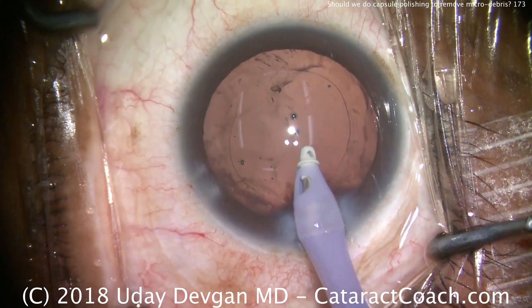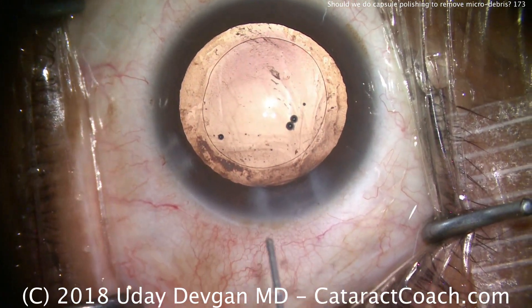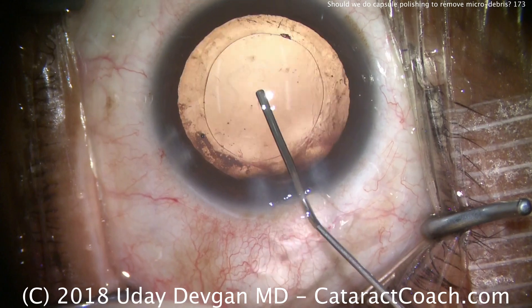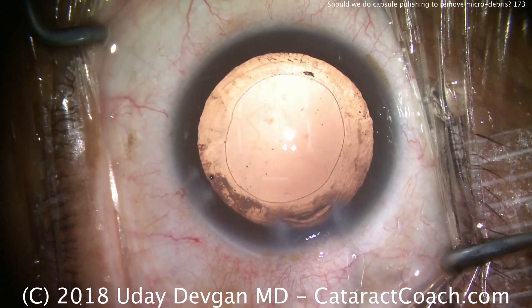You can use a bimanual approach. Some surgeons like a power-wash technique with BSS on a cannula. Other surgeons even use dedicated instruments such as capsule polishers — the Shepherd ones. Here we're filling the capsular bag completely, and there's a nice round rhexis.